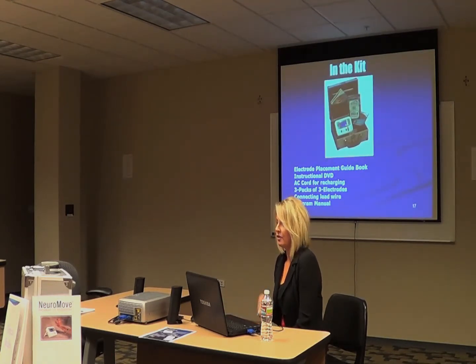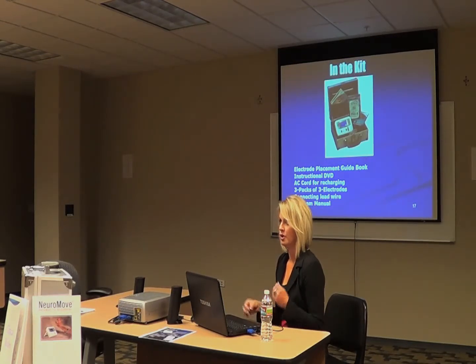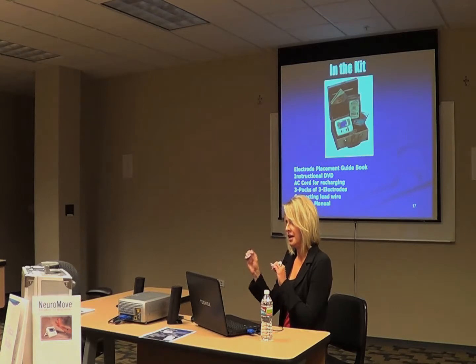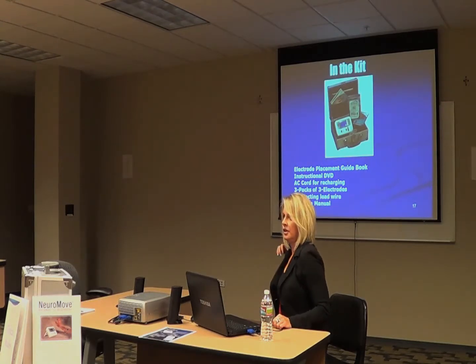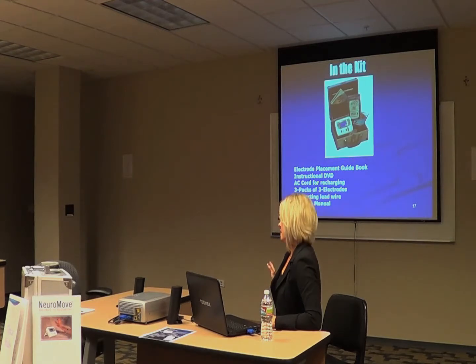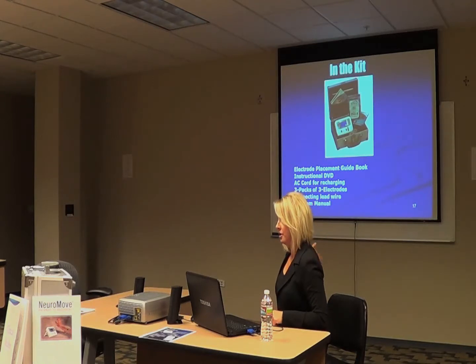In the kit that you'll get for this trial is the electrode placement guidebook. It helps you know where to place them. The place that I feel therapists have the most problem with placement is for shoulder subluxation. It gives you a really good guide of where that is, but it's just a real fishing expedition per the patient's anatomy. You've got to work with it a little bit. And you want to get a really good contraction so that when they're working, it pulls them up and they can actually get a good shrug out of it. I tell patients when they're trying to do that to maybe think about shrugging into a jacket or reaching back to do something that you would do with your shoulder to imagine.